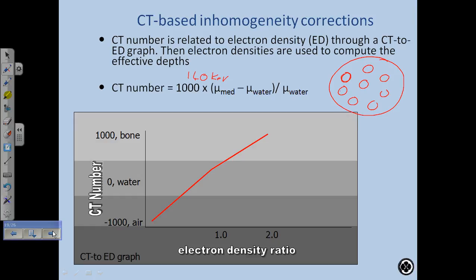So can you do it with cone beam on the treatment table? Well, cone beam is also 140 keV. Oh. Yeah, unless you use Siemens. Siemens has an MV cone beam, okay. And so you could do it with Siemens cone beam. So it'd be interesting to see how this would change with the tomotherapy unit. Actually, why don't you ask Brian Tom that? I wonder if he's done that.